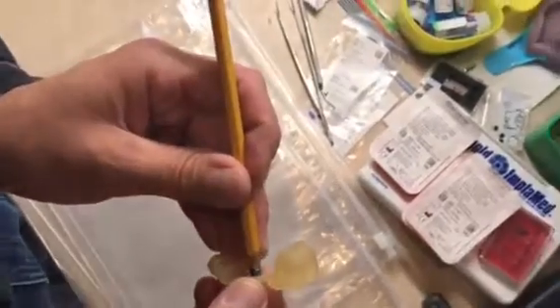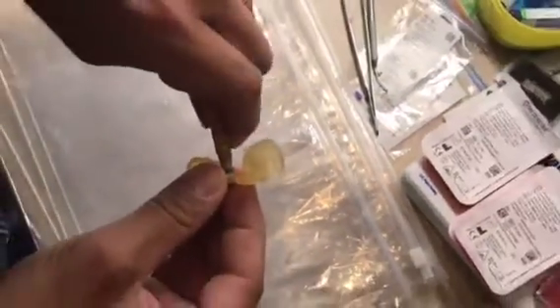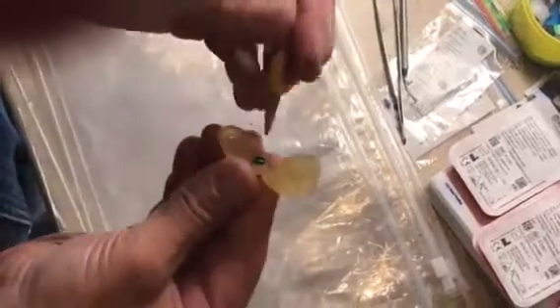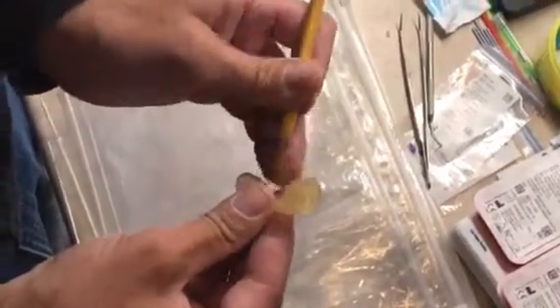We're just going to take this and line it up. We're going to push it in and wiggle it a little bit. Hopefully... this one's a little tight. Let me see, make sure it's going in straight. It is. And ideally, I want to have — for the future — a tool that's going to press this on a little bit more evenly.